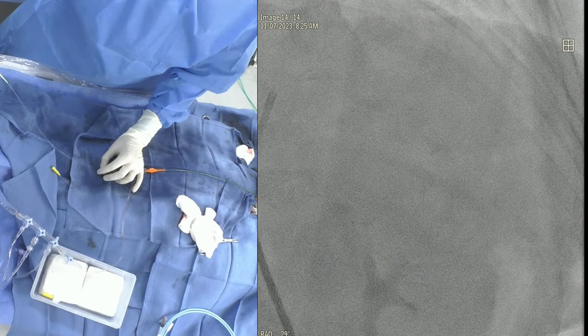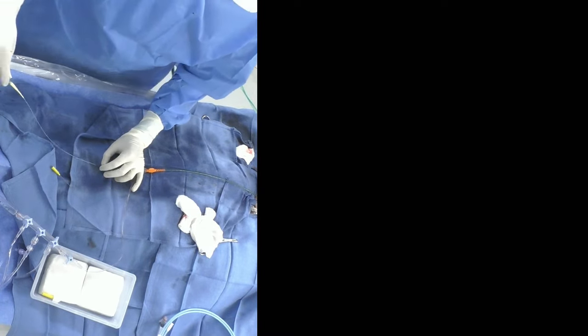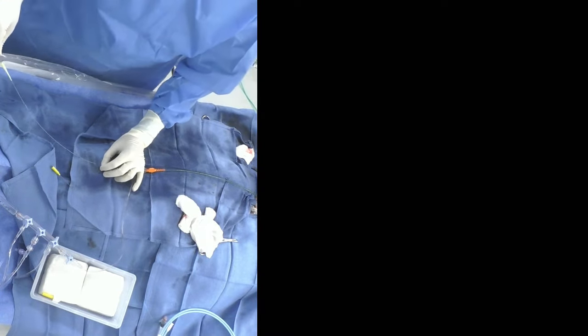What is the EDP? Normal EDP. Gives a lot of fluids. Yeah, give them a fluid bolus. Yeah. There's a problem. Okay.